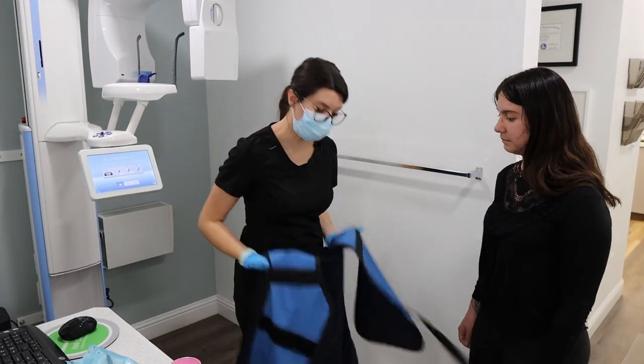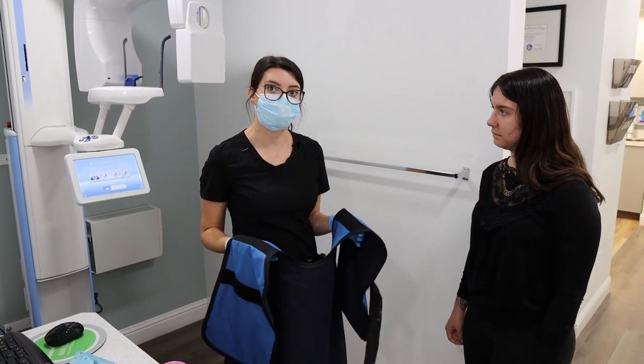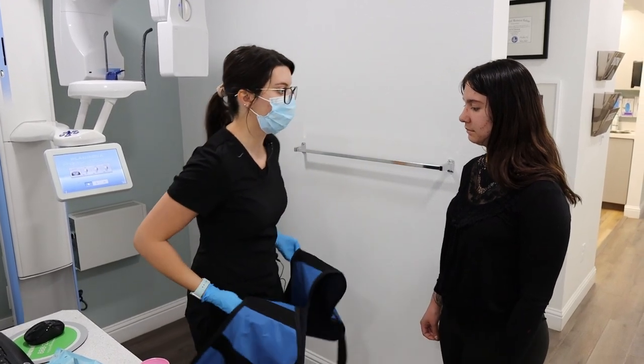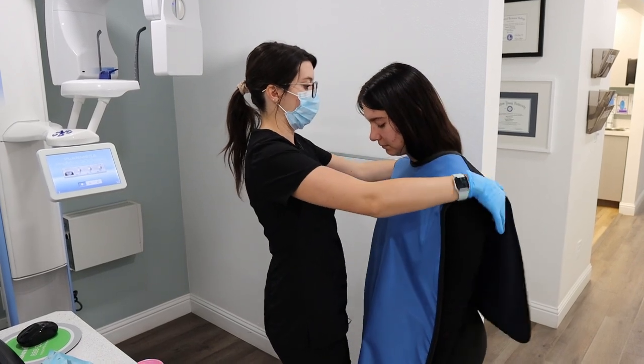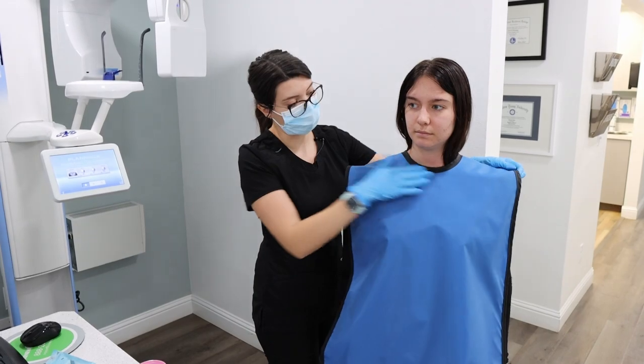This is the poncho for the pano. You'll ask your doctor whether it's required or not. In this case, we will be putting it on the patient. When you place this on the patient, you're just going to set it here, and you want the front of the poncho to be right against the neck.